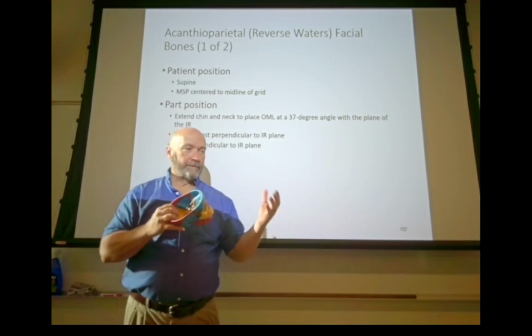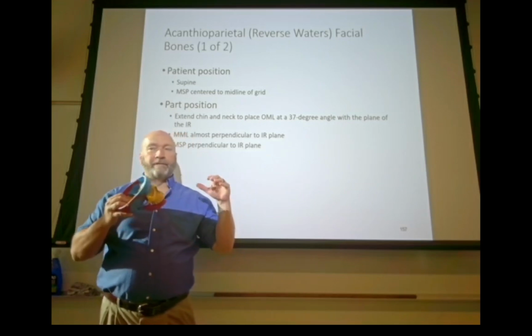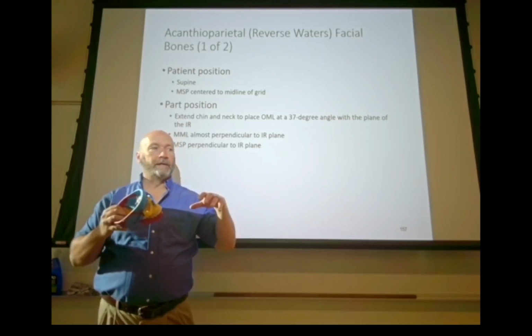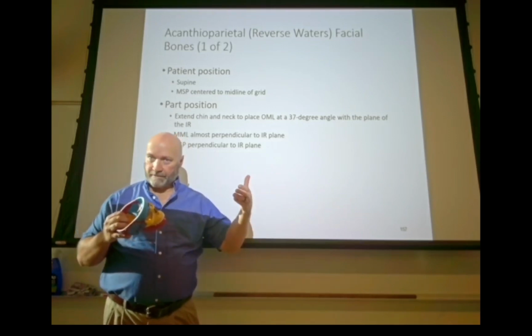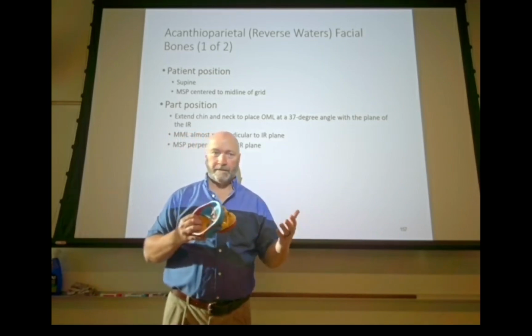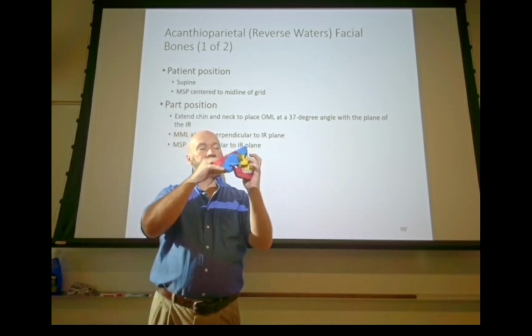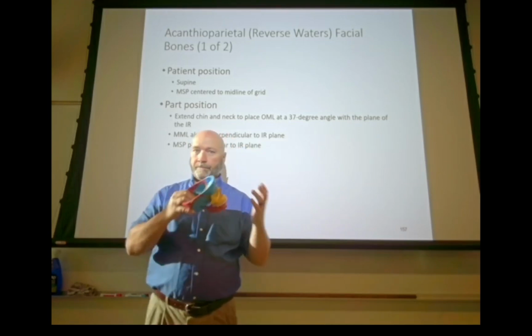and if you think back to our interphalangeal joints, if we have any kind of a bend in our fingers whenever we shoot our hands, what happens to our interphalangeal joints? They close, right. Or if you don't use central 15-degree angulation on your central ray for the toes, what happens to your interphalangeal joints in the feet? They close, right. So if the floor of the orbit is not perpendicular to the image receptor, then we could close that fracture up. All right.